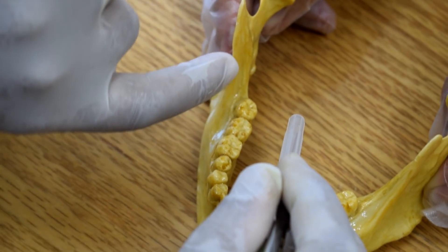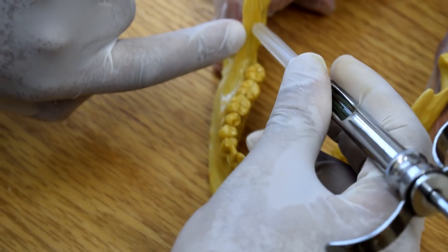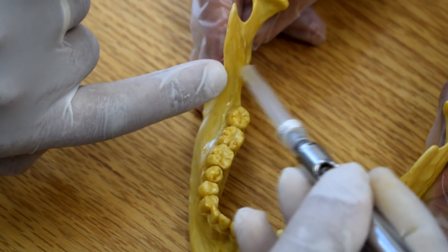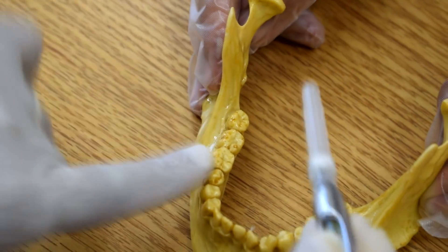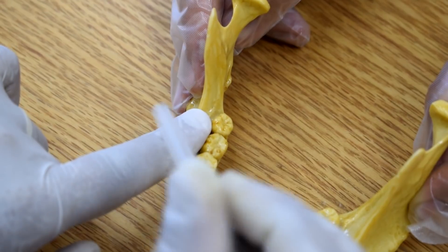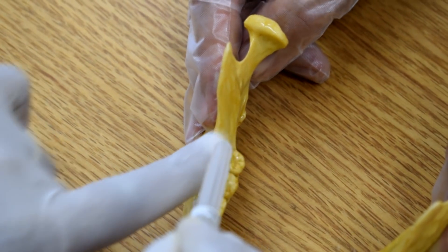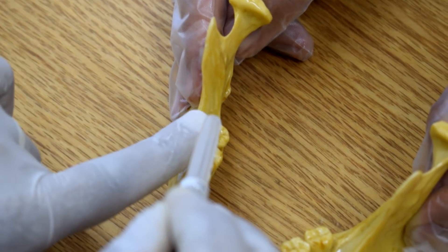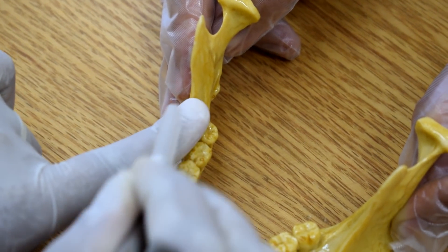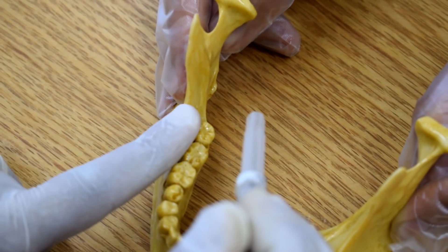When you turn your finger, you will only feel the external oblique ridge and you will be so lateral, away from the right area. The right technique is: while I am proceeding to trace the external oblique ridge with my fingernail, I will make this motion. I have to try to feel it only by the most lateral area of my finger bed.